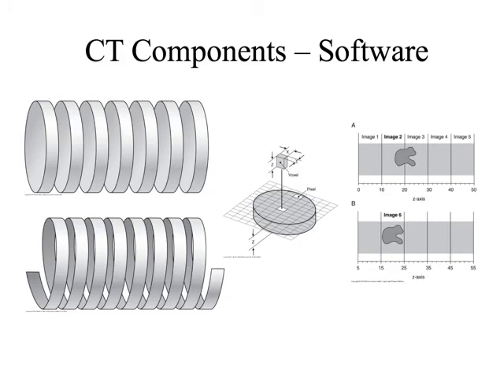Okay, so now that we've addressed all these major components of hardware, let's talk a little bit about the software. And the big thing here is we've talked about there's different kinds of data, right? So this form up here, I'm going to ask you to know that this is called axial. And then I want you to draw the no smoking sign around it, right?